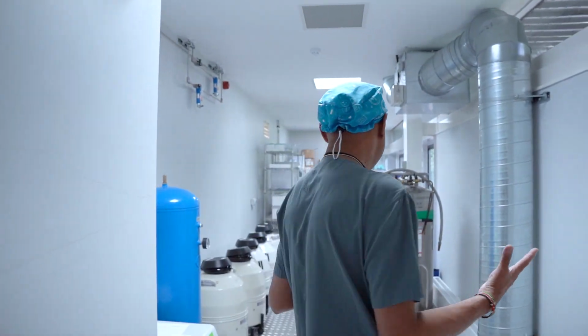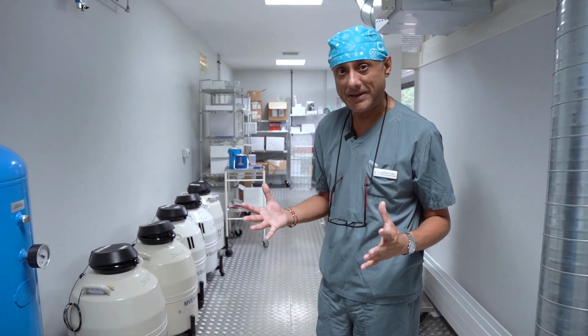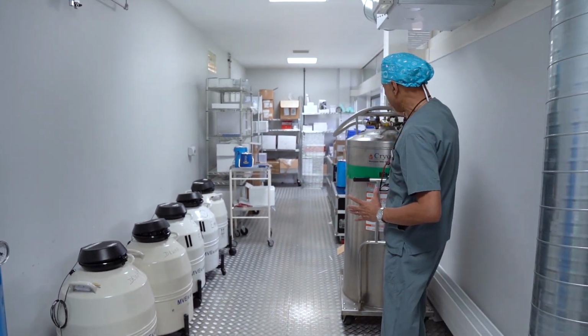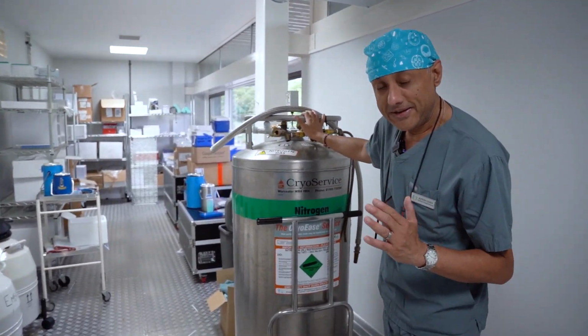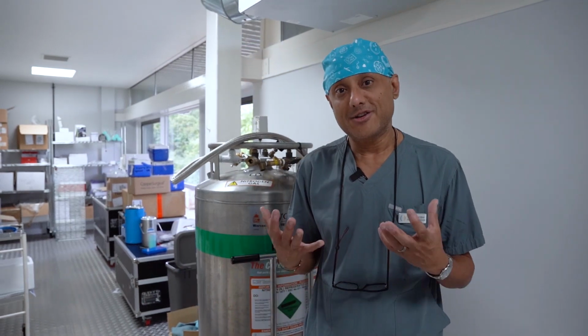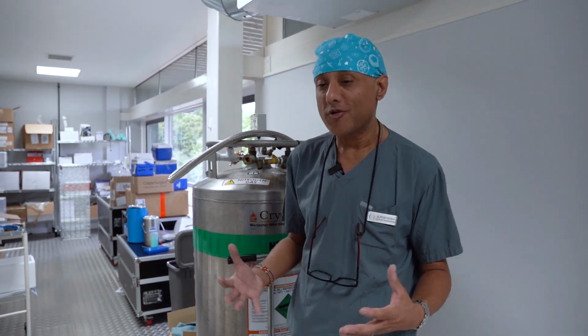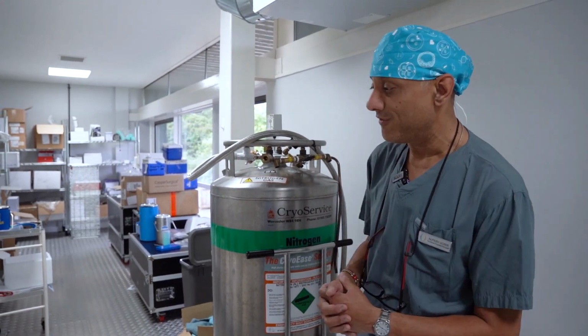You may hear some very loud background noise, and in this room you can see we have aluminium flooring. That is because there is liquid nitrogen that is being kept in this room. And these are the containers that contain the liquid nitrogen. Liquid nitrogen is stored at minus 196 degrees centigrade. It's extremely cold, so it can create burns. There are health hazards if staff handling liquid nitrogen are not trained and skilled. So it's very important that the training is given to the teams, and of course that there is adequate storage as well for liquid nitrogen.